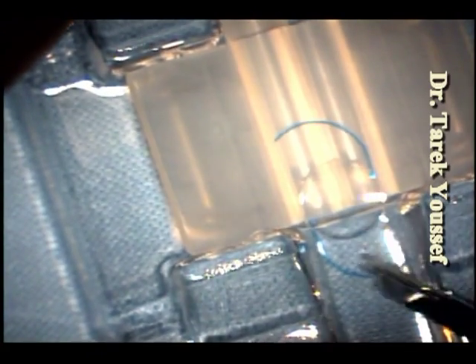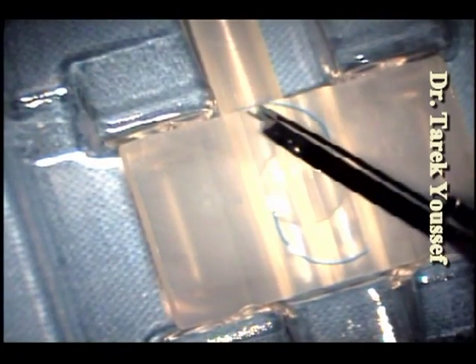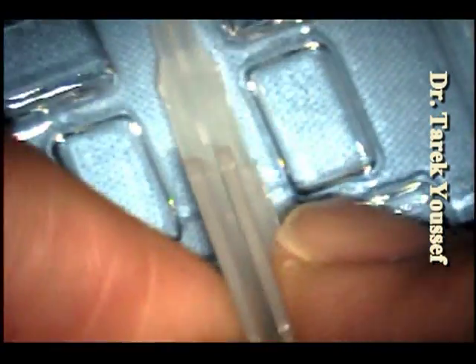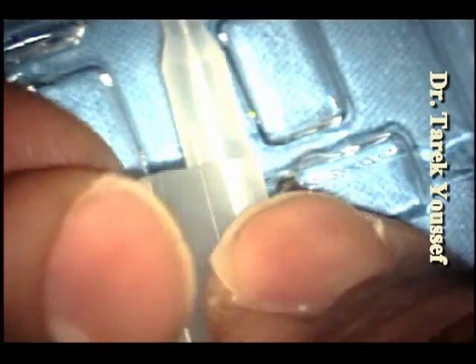We found that if the cartridge is not completely closed during the injection process, there would be a ridge that forms and that scratches the tip of the lens and the outer part of the lens. Attention should be taken to try to avoid this ridge — I'm showing it here with the cartridge and the forceps.